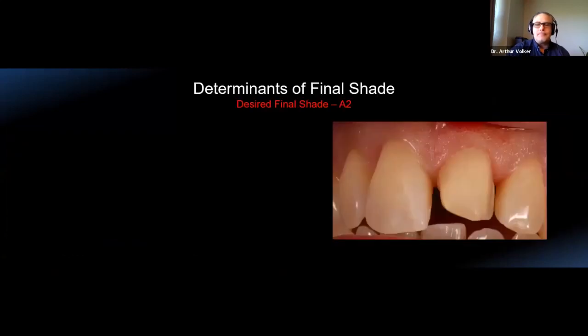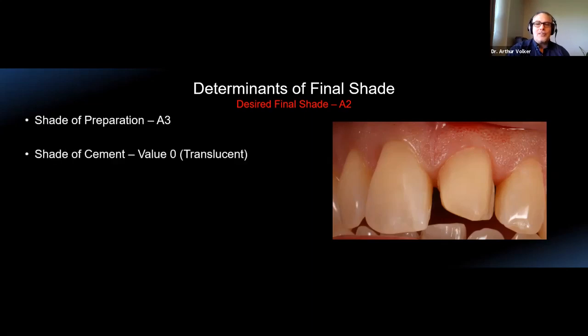But here's the preparation. And you say, okay, this was minimally prepared. And again, I don't want people to fall into this trap. Again, look at the negative space. Because there is a fairly large negative space in this area, even though the tooth is barely almost scratched in some areas, you still have to be very, very careful. All right, don't get taken in that a high translucent will absolutely work here. Now, there's some fantastic technicians, without question, who will do this in a high translucent material. But just take caution, because it may not always work out to your favor, in that you may have some unwanted and unexpected graying of the material.